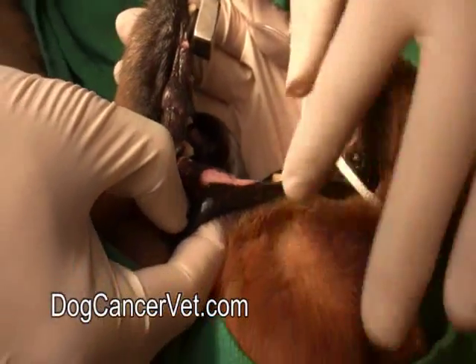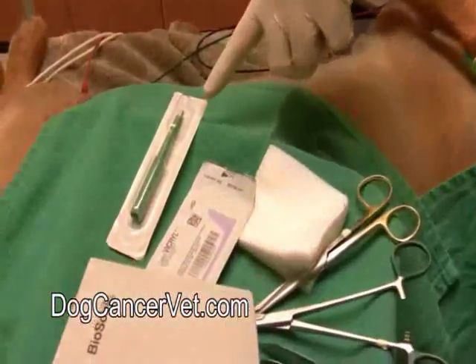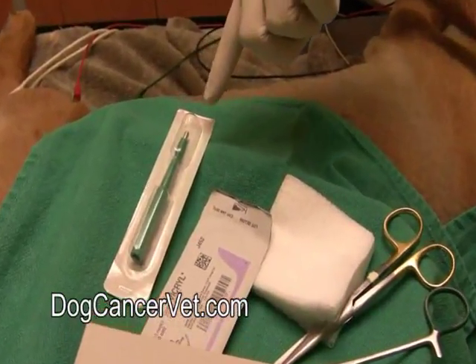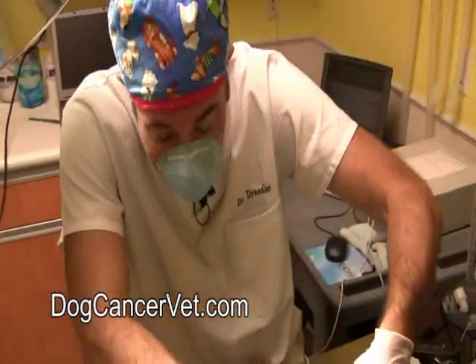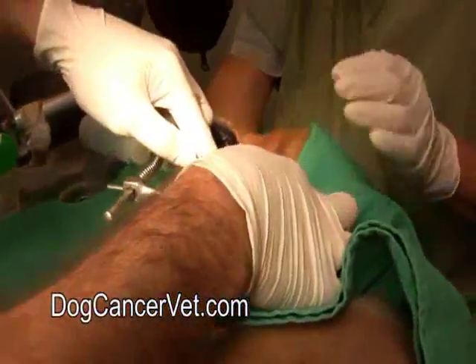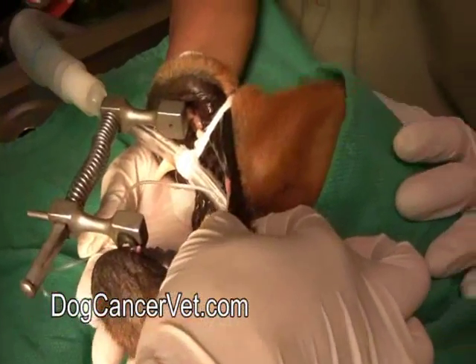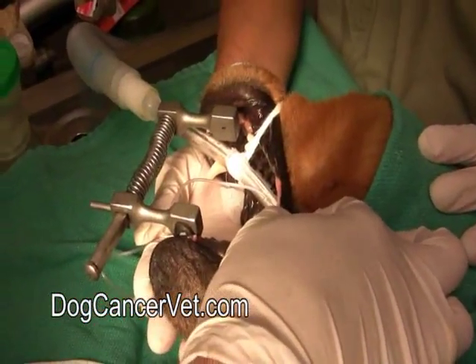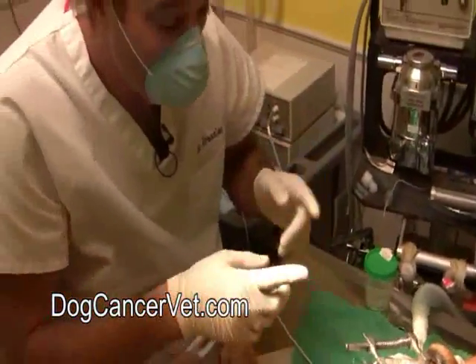So when we take our biopsy, we're going to literally be taking a little piece of this with this tool right here called a biopsy punch. That's an edge tool. It's got a little hollow cylinder, and the edges of the cylinder on the outside is actually a cutting edge. What that allows us to do is put it in the affected area right there, and it'll take out, like a little cookie cutter, a little circular piece of tumor, and then we're going to put that in some formalin, and we're going to send it off to the pathologist so we can get some answers. And then we're just going to stitch him up. He's already had his antibiotic injection, so we know he's not going to get any infections inside there. And then it's just a waiting game until we get that pathology report. So let's go ahead and get going.